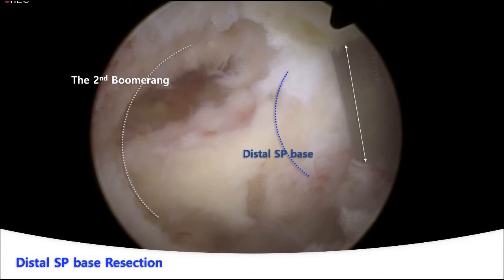The width of a chisel is about 5 mm. A 5 mm width resection of the distal SP base at one go has a risk of lamina crack or fracture, and the 5 mm resected area has very thickened lamina. So a little bit less sized resection, about 3 mm or so, is easier, safer, and plausible by chiseling.